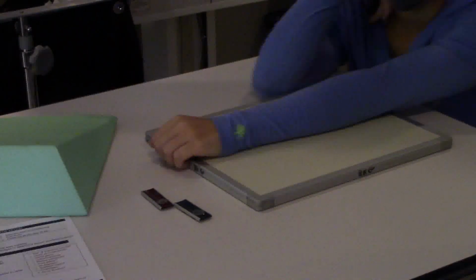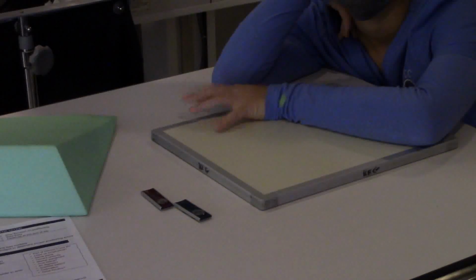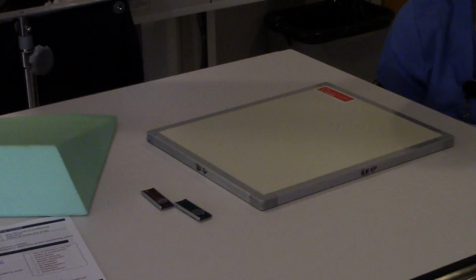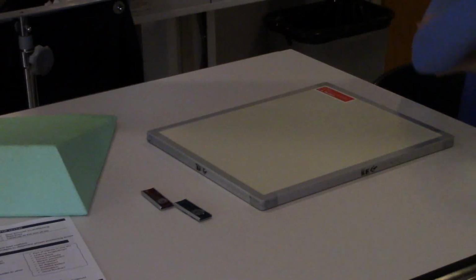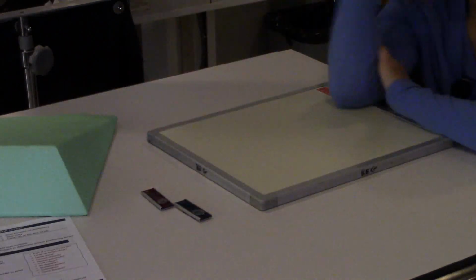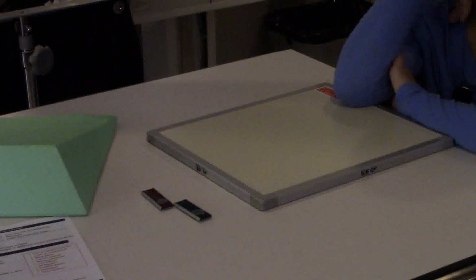Now, if you're using DR, it's not an issue. You're just going to be coning down to the size of the part. You've got plenty of real estate there to work with. But definitely you have to include all the wrist and all the elbow. And it needs to be in a nice, straight AP orientation with the epicondyles approximately parallel to the image receptor. All right, so Miss Kristen, do your thing. Position that patient.